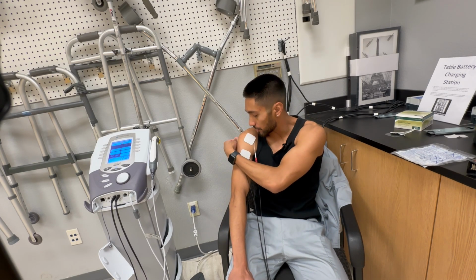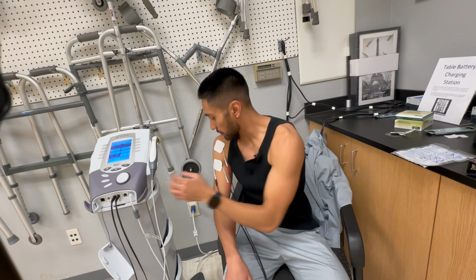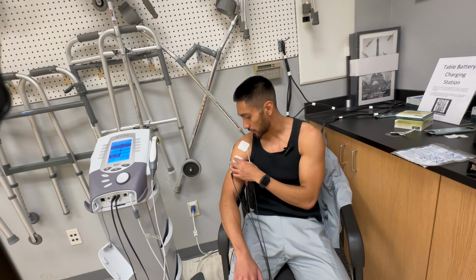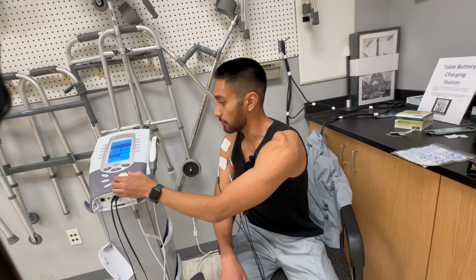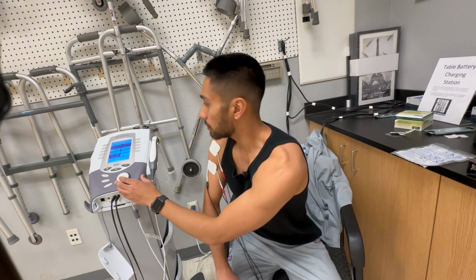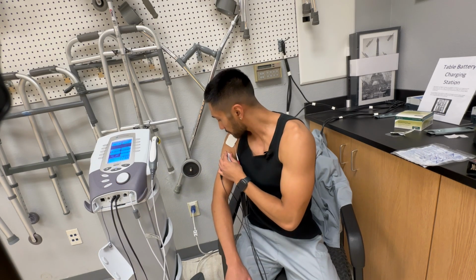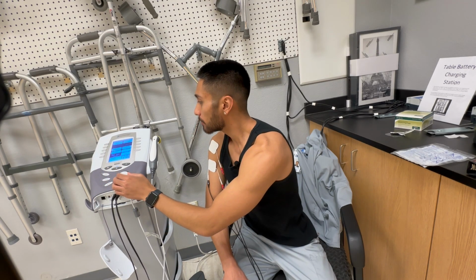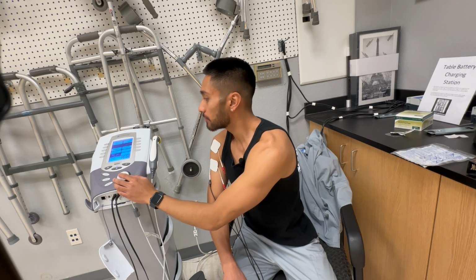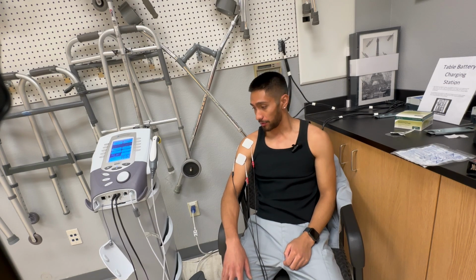I'm just constantly making sure that the pads are connected. I have to turn the intensity slightly up because I'm not feeling a tingling sensation anymore. Let's go ahead and get that up. Now it's just twitching with muscles. So we'll go ahead and... this is really where it's playing around and trying to find that intensity of comfort.